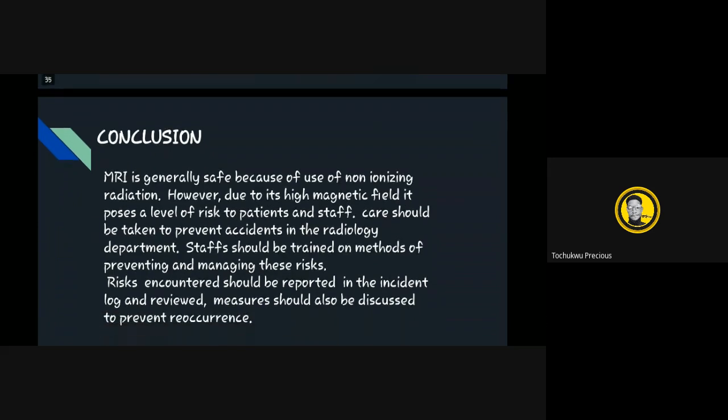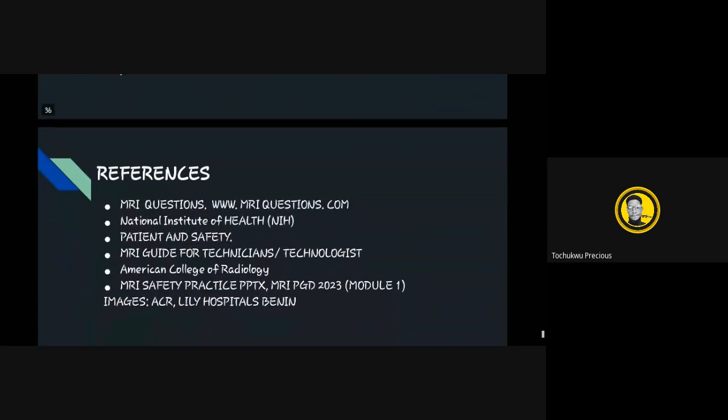Staff should also be trained on methods of preventing and managing these risks. However, if a risk occurs, it should be reported in the incident log and reviewed. Measures should also be discussed to prevent reoccurrence.